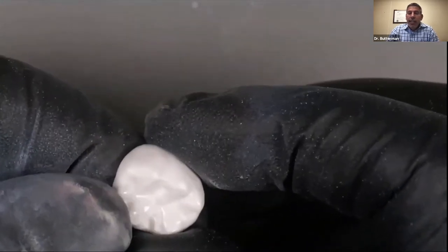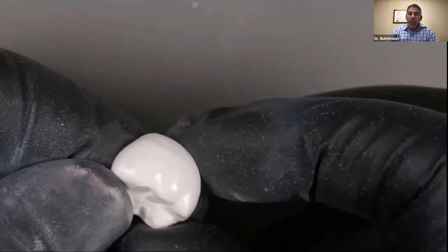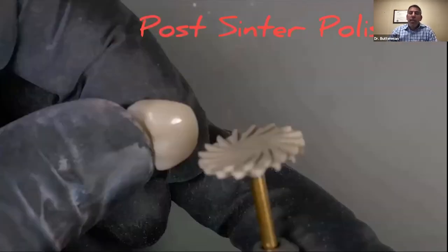So what we're going to do, as Kat said, I'm going to use maybe some compressed air. I want to get rid of any powder that's still on there. Maybe we'll use just a soft brush and just take away any of the zirconia dust that's on there, because you don't want that to bake into the restoration. And then we're going to run through and sinter it. And when it comes out, you're pretty much done.